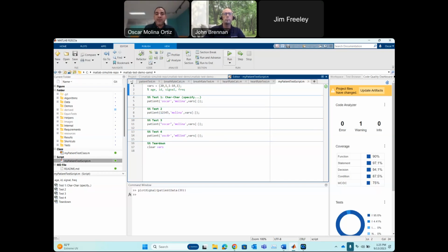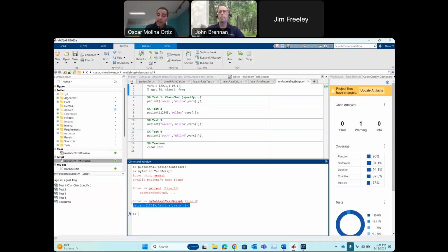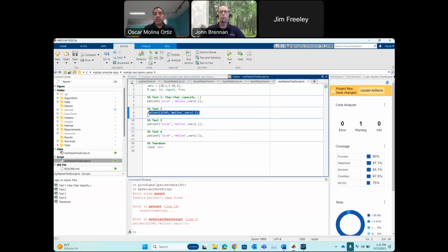So what happens if we run this? If we run this script, it errors out. It's telling us, hey, line 16, something happened. We couldn't get there because something happened at line 8, which was expected. We were just talking about it. This test shouldn't pass. Now, the question is: is this a good way of testing your algorithms? Perhaps not, for a couple of reasons.